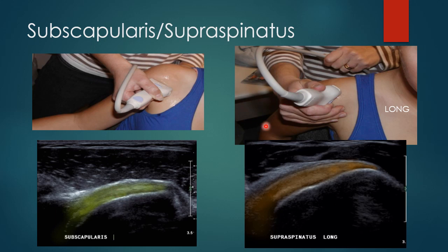Regarding the supraspinatus tendon examination, I prefer to put the probe over the AC joint and slide it anteriorly till I see a tendon. The first tendon seen in this region is the supraspinatus tendon. All the tendons are examined in TS and LS views in order not to miss any pathology.